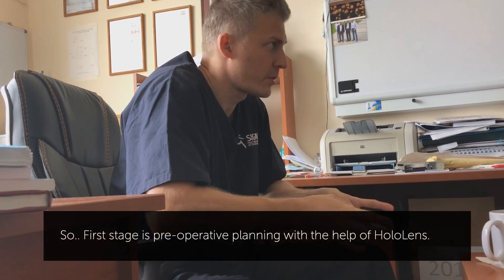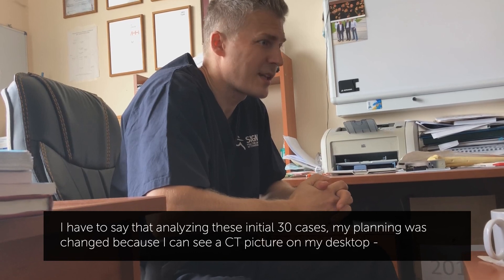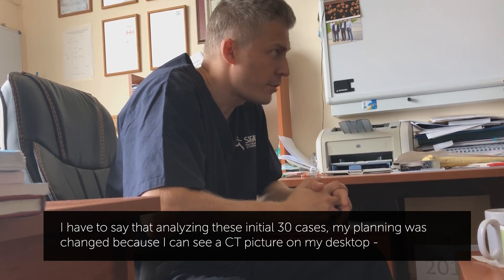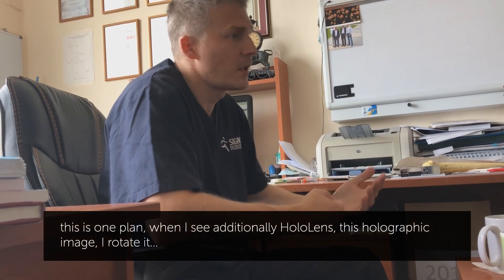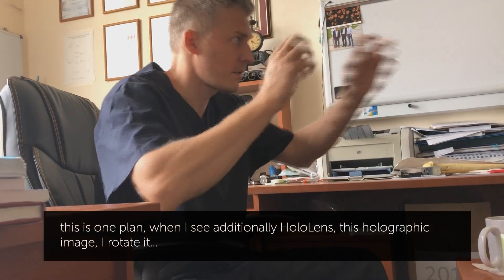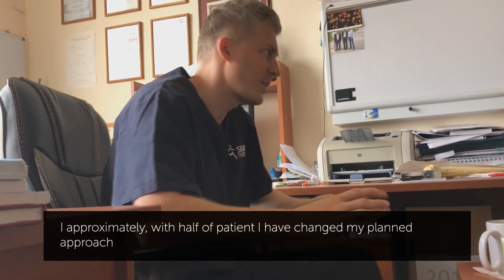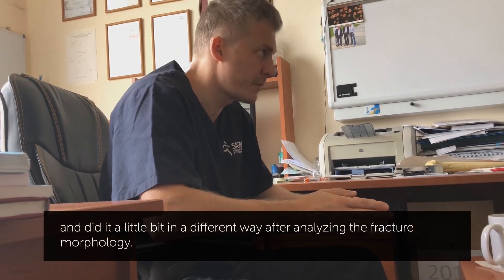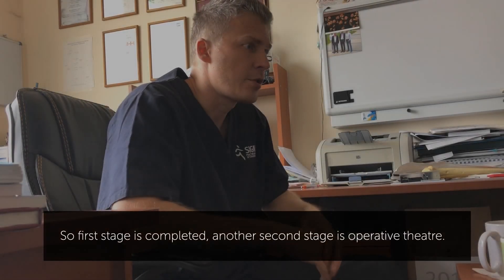The first stage is pre-operative planning with the help of HoloLens. Analyzing these initial 30 cases, my planning was changed: when I see a CT picture on my desktop, that is one plan, but when I additionally see the holographic image in HoloLens and rotate it, in approximately half of patients I changed my planned approach and did it a little bit differently after analyzing the fracture morphology.